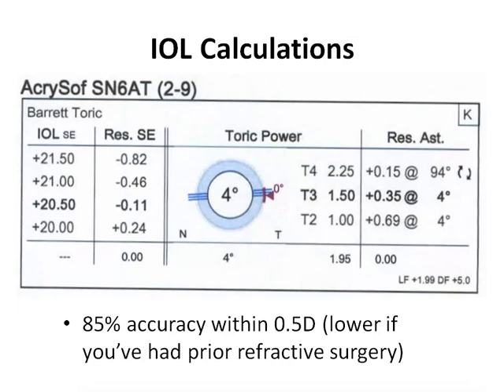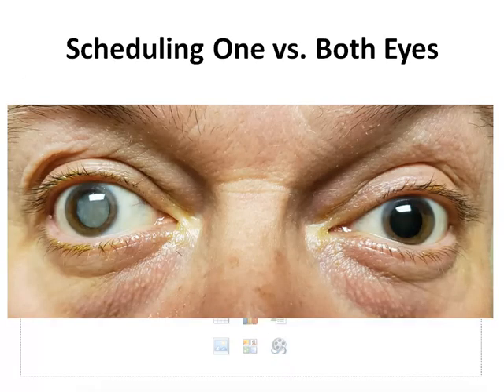In patients with a history of previous refractive surgery, these calculations are less accurate. It is crucial that your surgeon is aware of any prior refractive surgery so we can adjust our calculations as necessary. Because of these limitations, there's always a possibility that you'll need a light pair of glasses to fine-tune your desired target, regardless of who does your surgery. Even patients who end up with perfect distance vision may also opt for full-time bifocals after surgery to avoid constantly taking readers on and off. We always provide an updated prescription for patients as part of the standard 1-month postoperative visit.